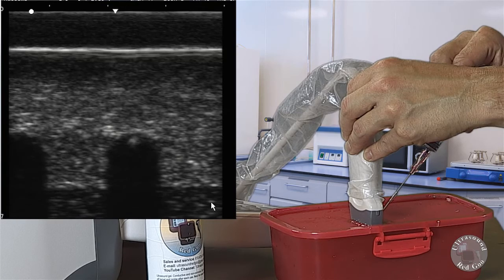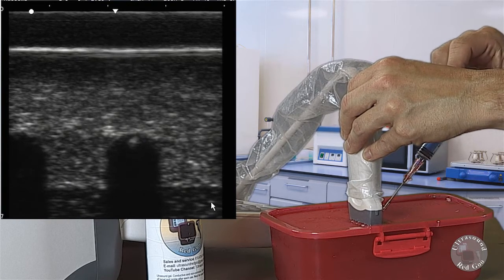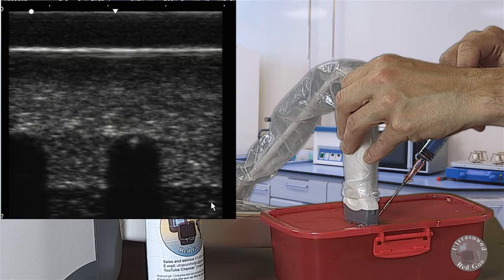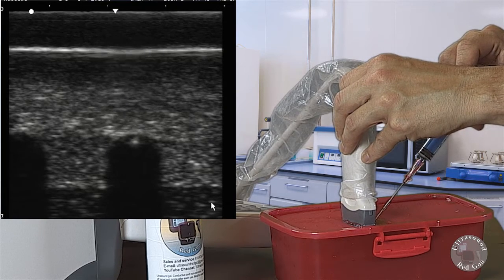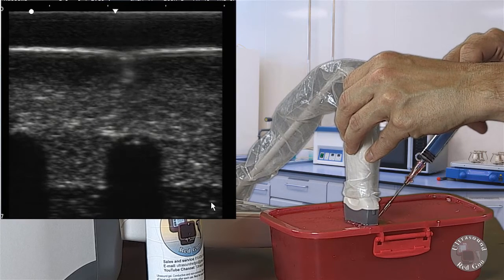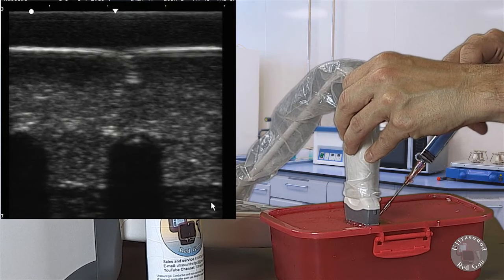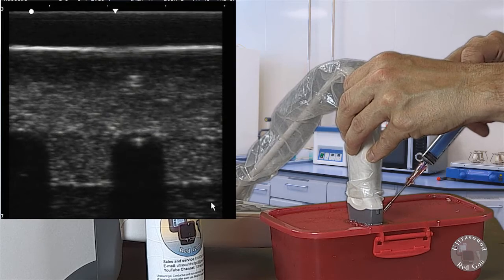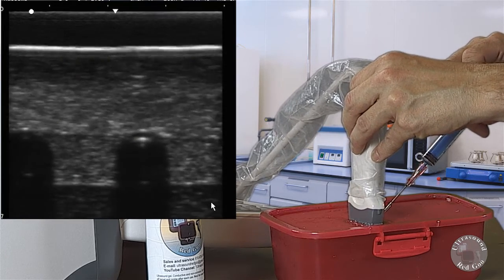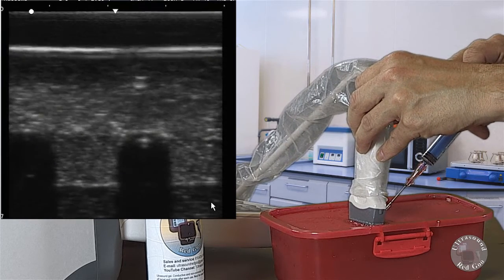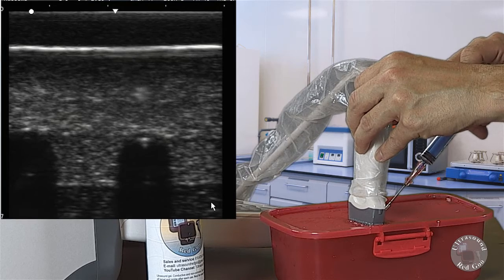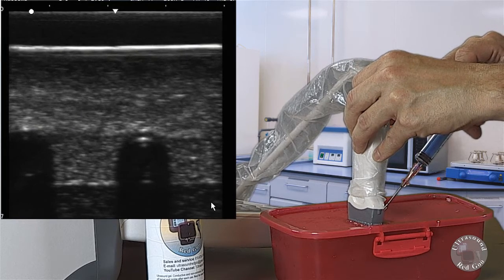I'll puncture now. Now I have two choices. I can either slide the probe until I find the end of the needle tip, so that little white orb goes all the way away - we call that hyperechoic. Or the other thing I can do if anatomy does not allow me to slide the probe, I can just simply tilt. I'm going to find where the hyperechoic orb ends - that's the tip of my needle. I'm going to go ahead and advance all the way down.